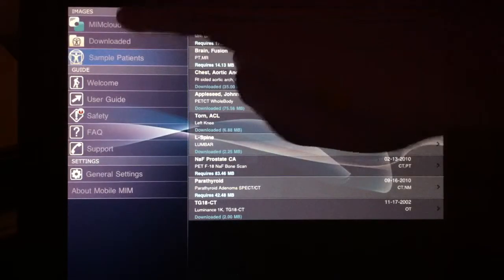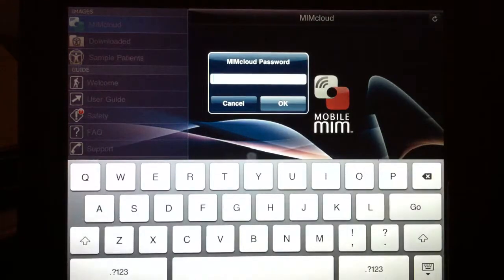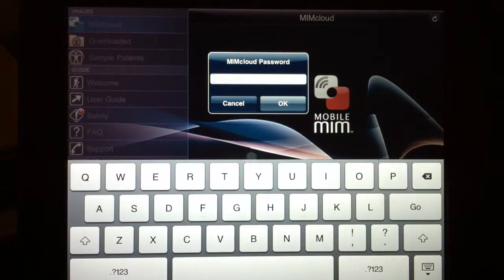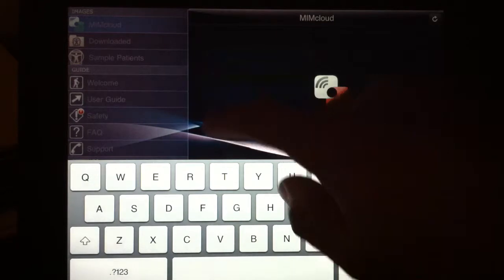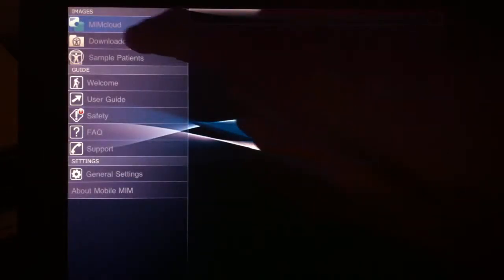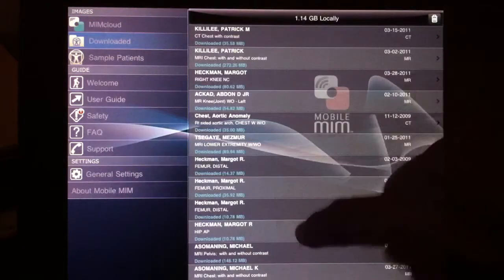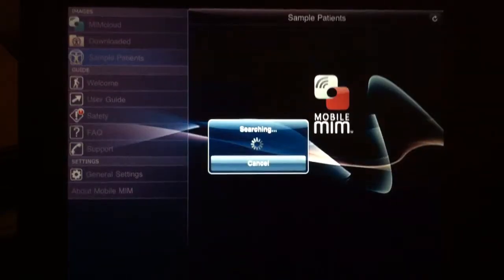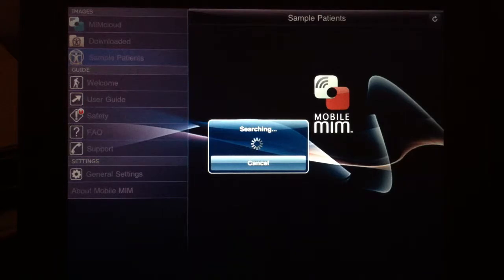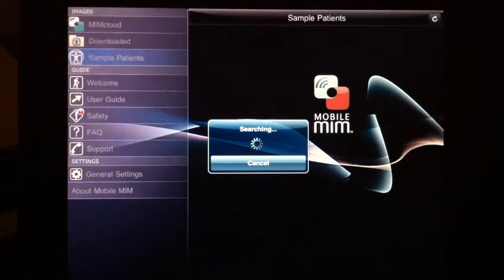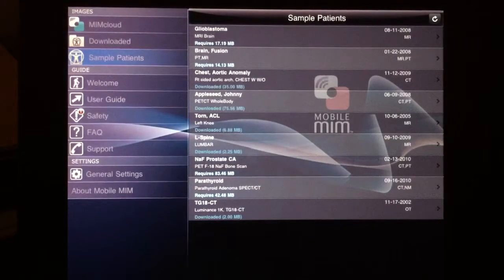If you click on the MIM cloud, it'll request your password, and this is how you get in and see the studies that you've uploaded to your cloud server. The studies that you've already downloaded are available here, and as you'll see, they're listed simply by the study type and title and not grouped by patients. So that can make it a little bit unwieldy if you have a lot of studies.